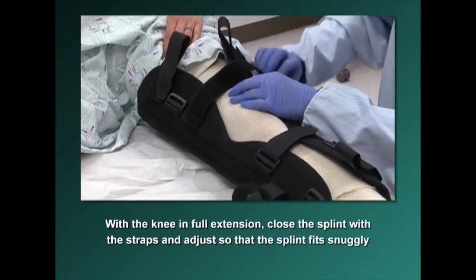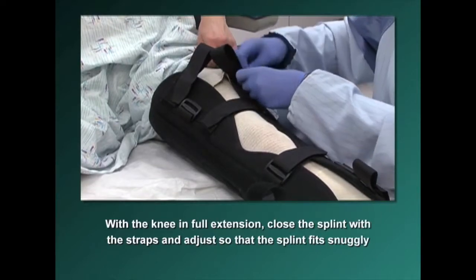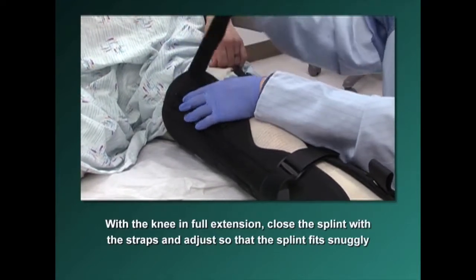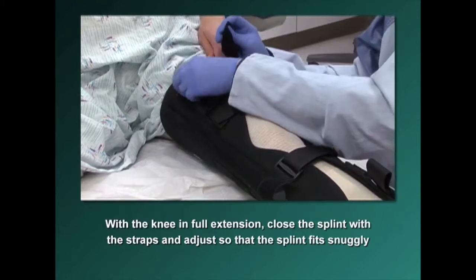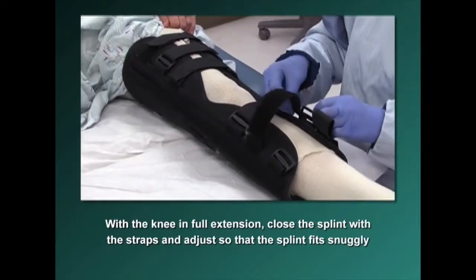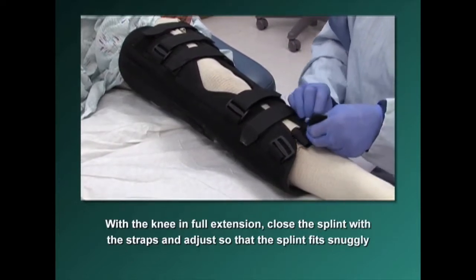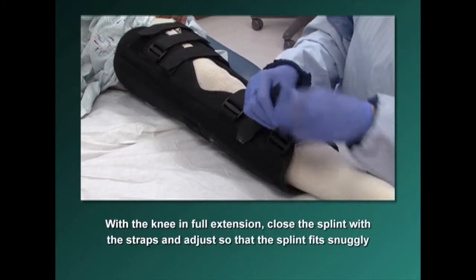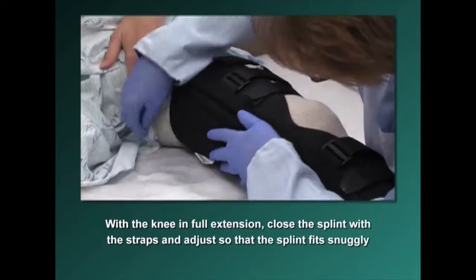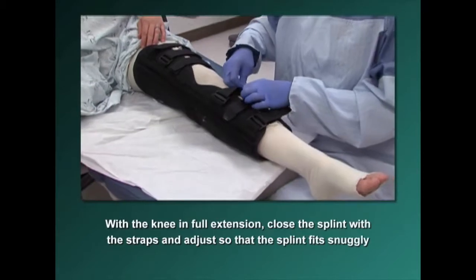I usually do these two straps first so I can keep track of where your knee is. Make it nice and snug, but not too snug — that will cause pressure areas. Check underneath to make sure there are no problems, and confirm that your knee sits right in front of the splint. If it's a little too loose, readjust.